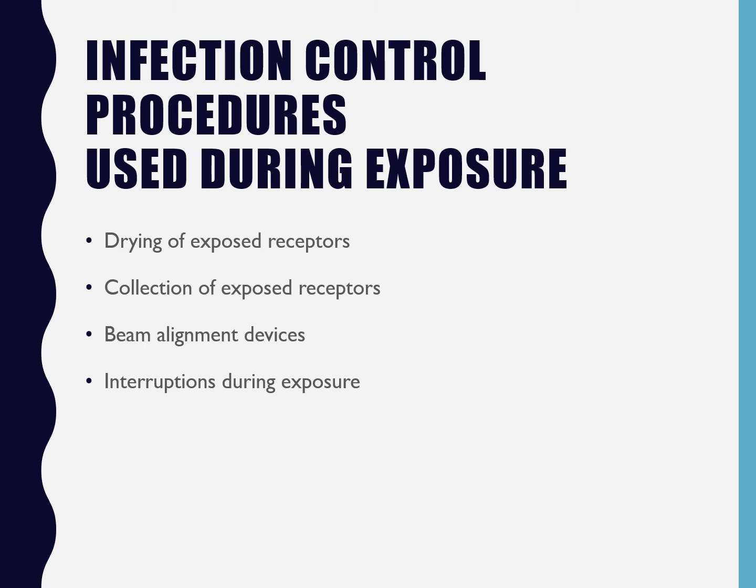Also, I need to say, the best way for the radiographer to minimize contamination is to touch as few surfaces as possible. So if you have everything laid out for you and you're not having to make any adjustments because you already prepared everything, you're not having to go dig around in drawers to get something because you already have all your stuff, then you're going to be able to reduce that spread of infection better than someone who maybe doesn't have everything set up already.